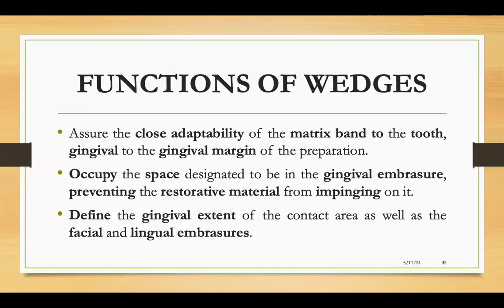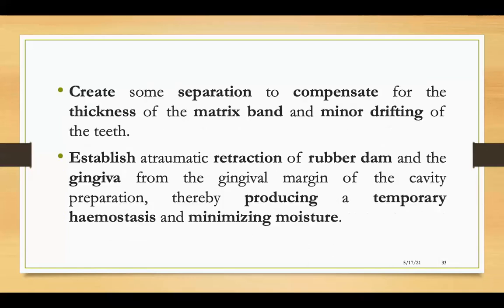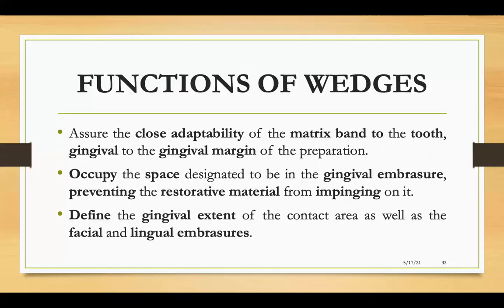Functions of a wedge. Now, this is most important. A lot of people will ask you throughout your dental career what are the functions. So you just end up saying that one thing that you do. You're like, oh, when I'm doing a class 2 restoration, I place a wedge just to separate the two teeth. That's so wrong. That's right, but that is very limited knowledge for you. So you should know all these functions that I'm quoting here.